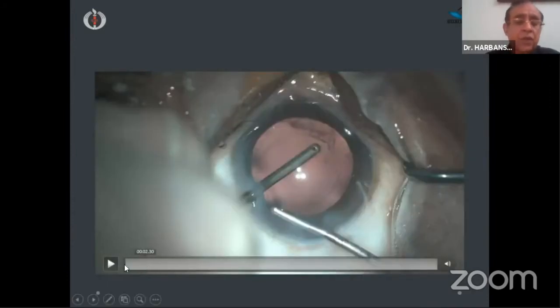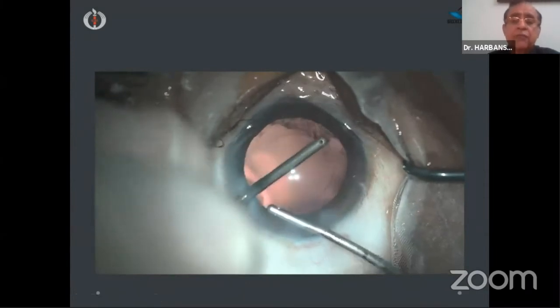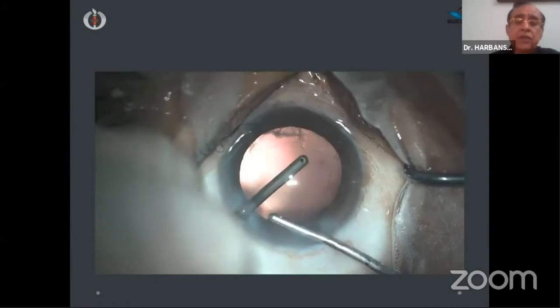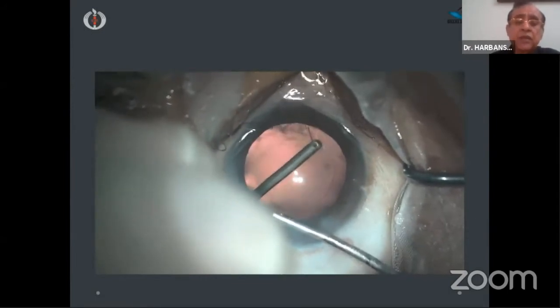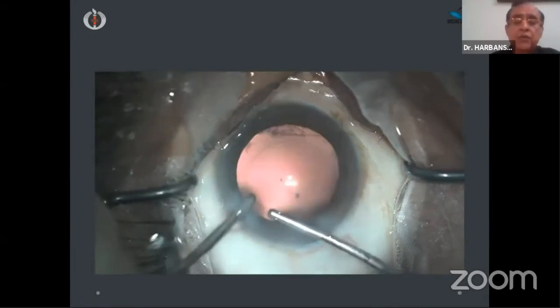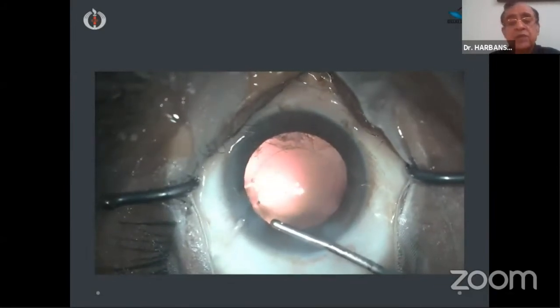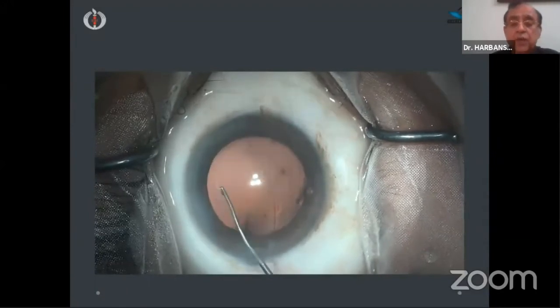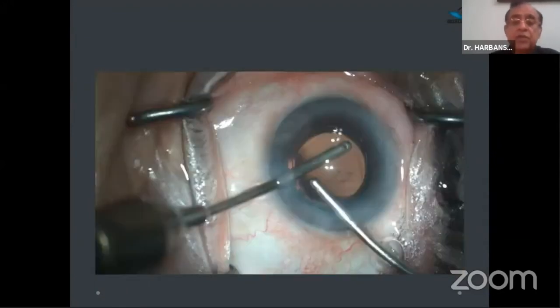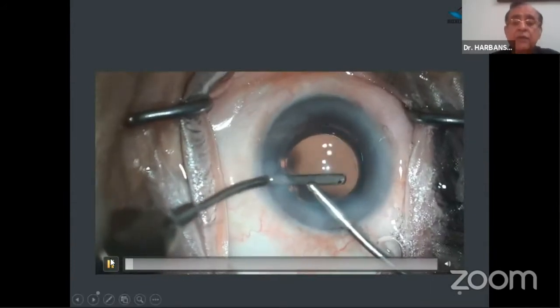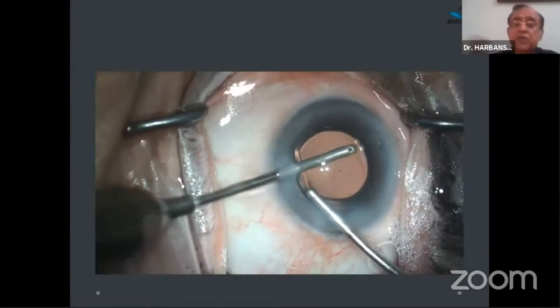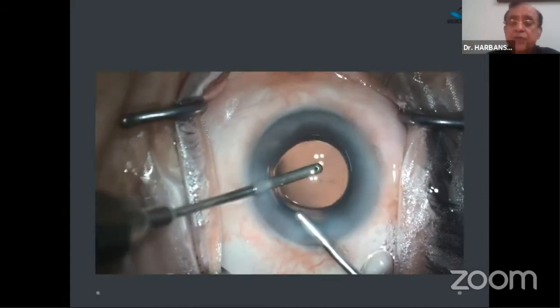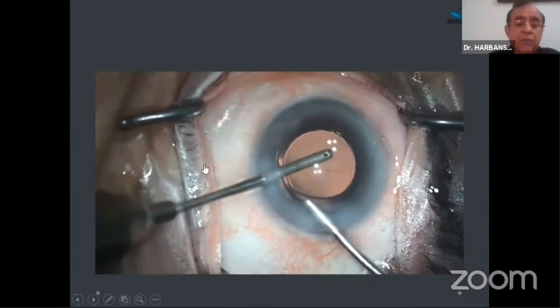In another case, there is a fold on the side where cortex is being removed, indicating some broken zonules. When pulling, you can see the edge of the bag moving. In such cases, place a CTR — though the subluxation is small, you may never know if it was traumatic or progressive, and patients now have a large life expectancy. A CTR ensures the lens is well centered, which is critical especially for multifocal or aspheric IOLs — if decentered by more than 0.5 mm, it compromises quality of vision.